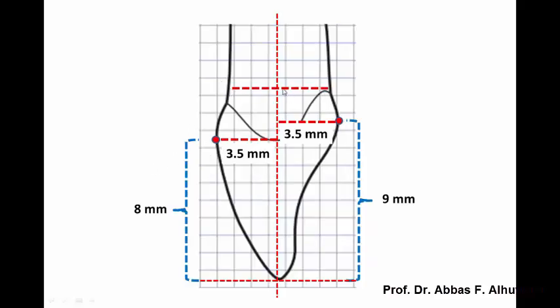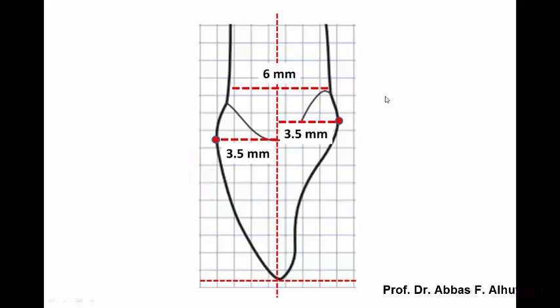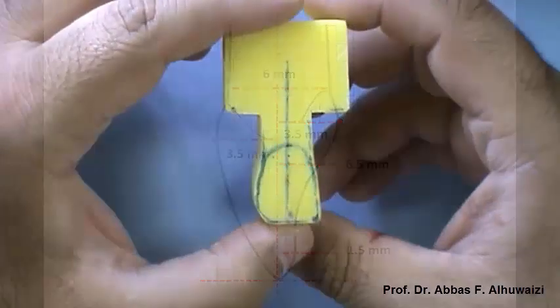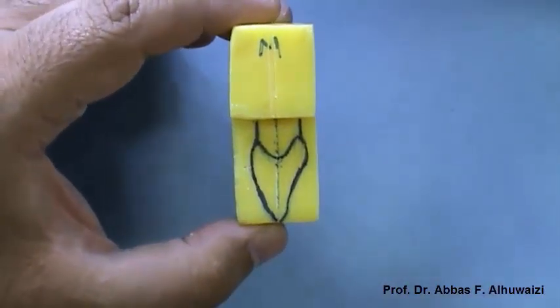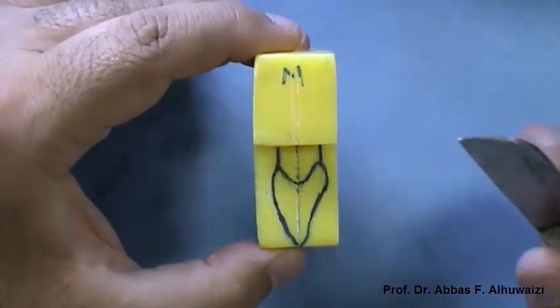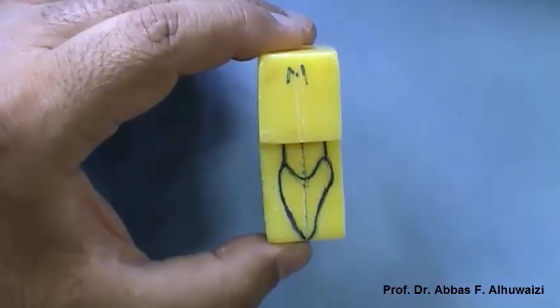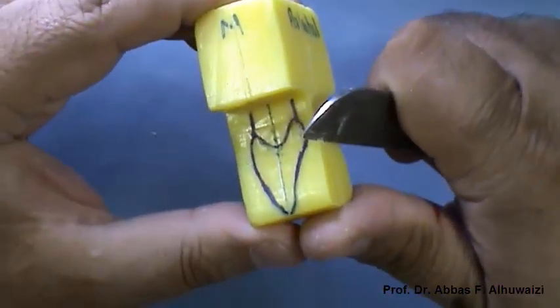The width of the root is 6 mm. The slope of the incisal edge ends about 1.5 mm lingually, while the end of the cingulum is at 6.5 mm from the incisal edge. In between these two points, a concavity is shown. After drawing the mesial surface on the block, we bring the plaster knife and cut the excess as we did on the labial surface.